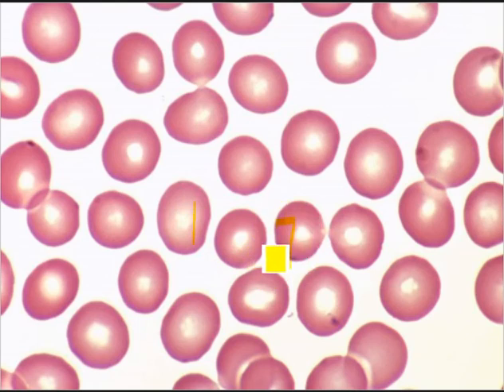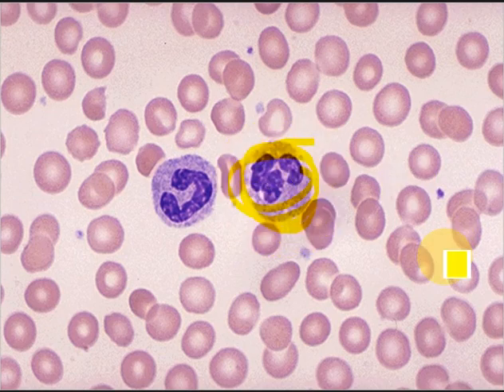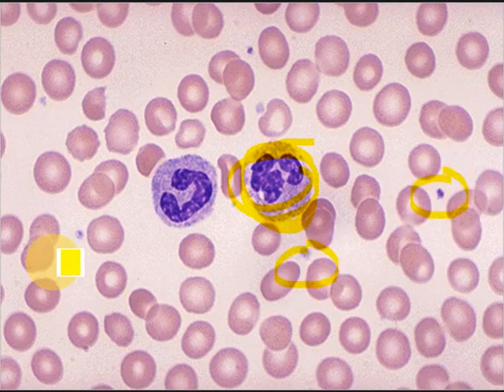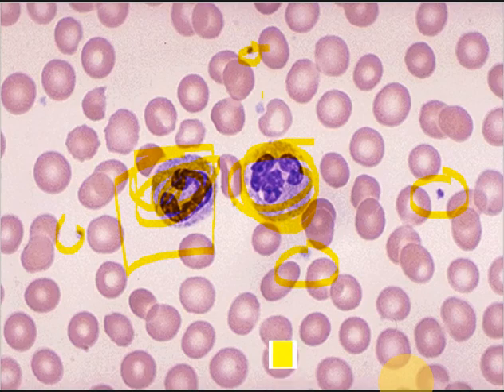Okay, pop quiz. What is this? Yes, your erythrocytes or your RBCs. How about this one? Yes, very good, your segmented neutrophils. How about this one? Of course, your thrombocytes or your platelets. Who is this one? Very good, your band neutrophils.